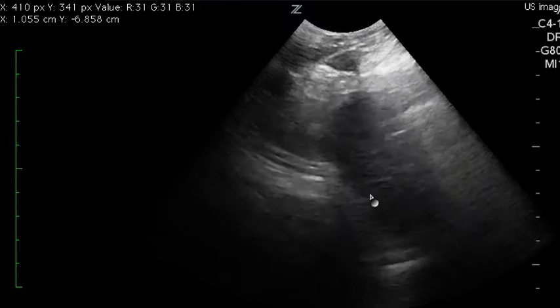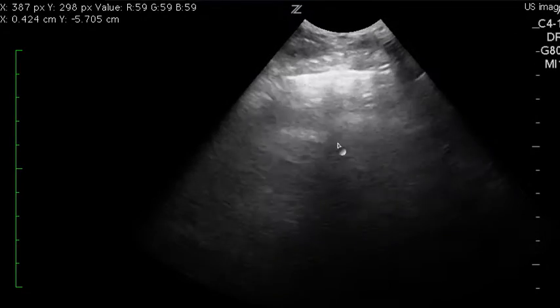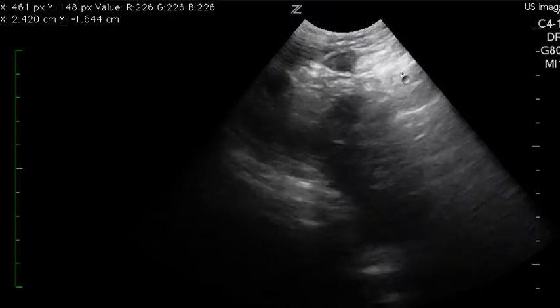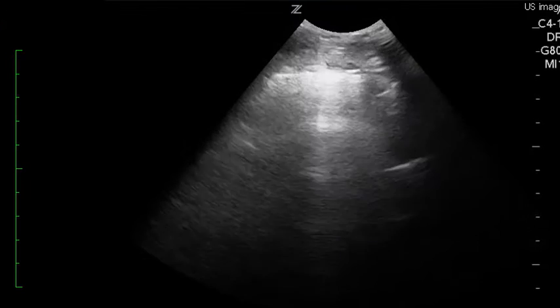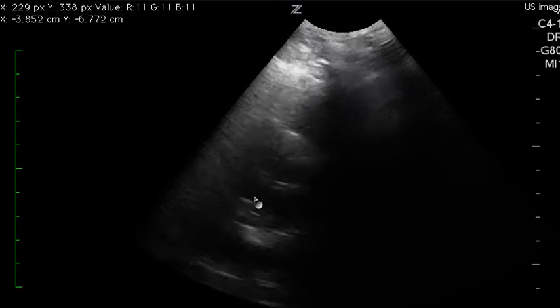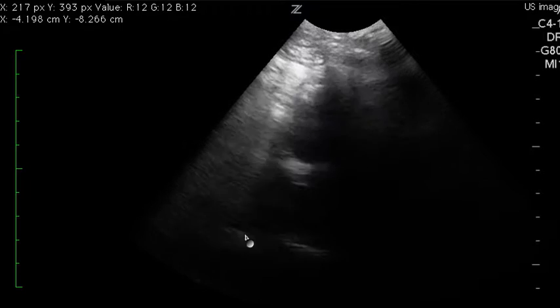This is your cardiac view. It is a little unclear to me. These lines here are gas or air from the lungs, most likely, so I can't really make a clinical decision on this clip.